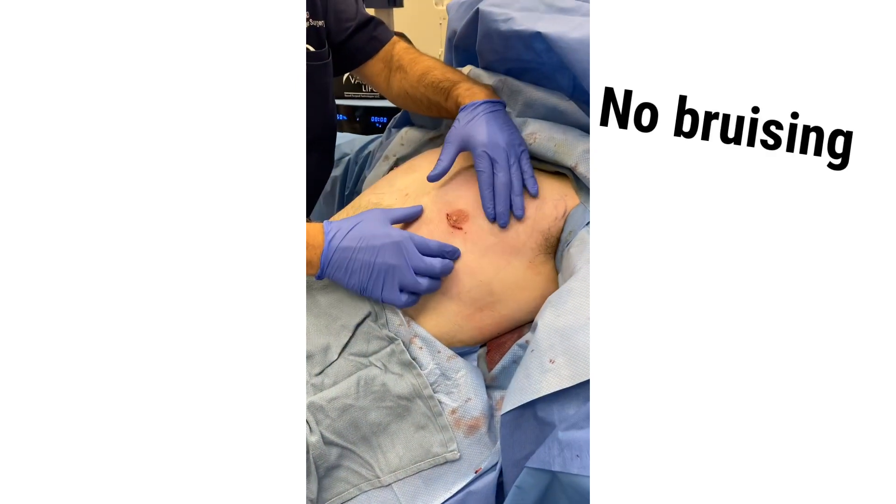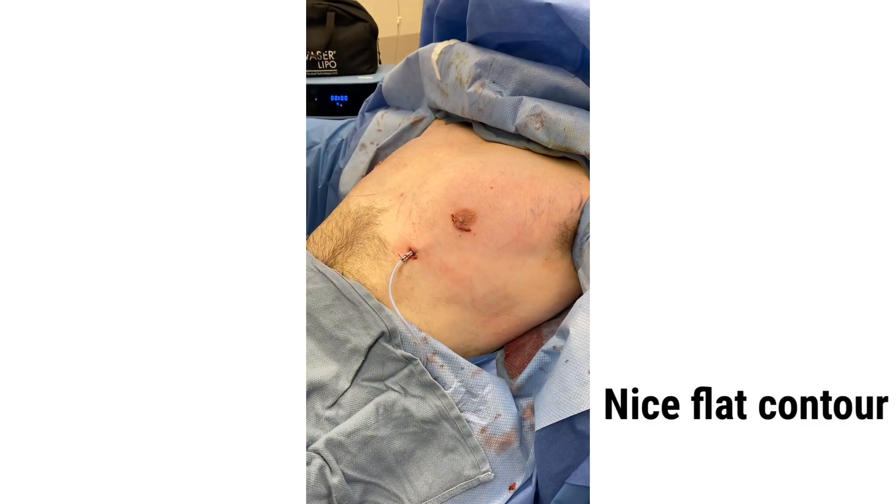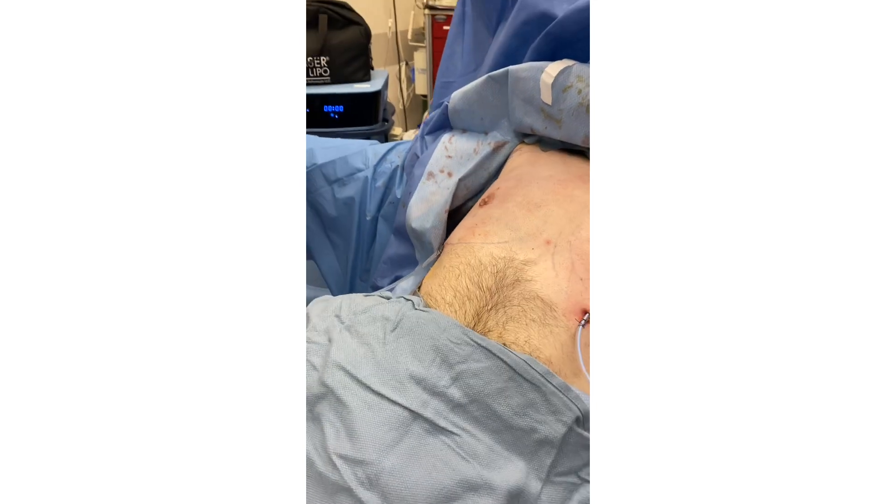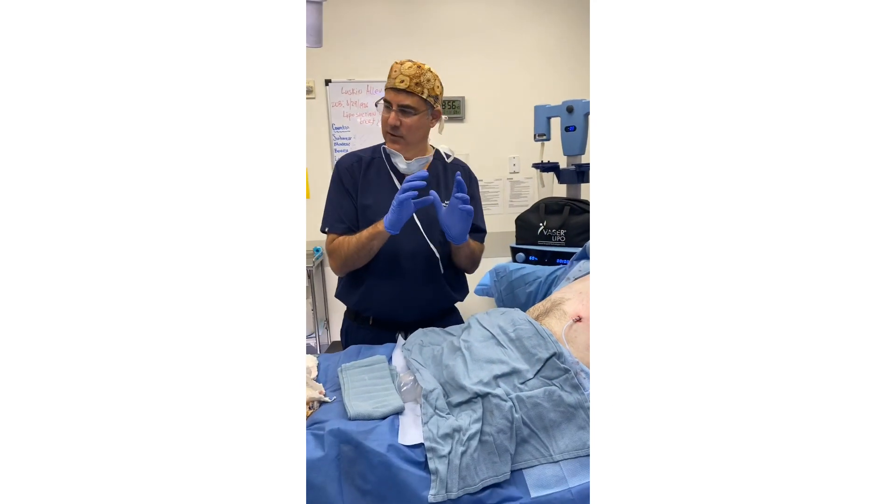We try to leave a little bit of tissue under there so it's flat and he'll still have some good contour, but it's not dished in. I did liposuction first and then we excised the actual breast tissue.